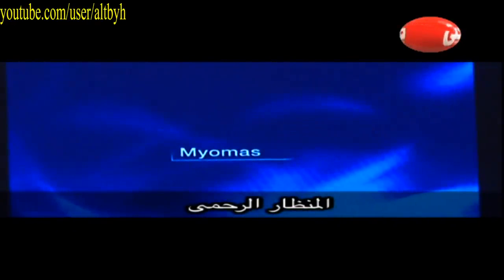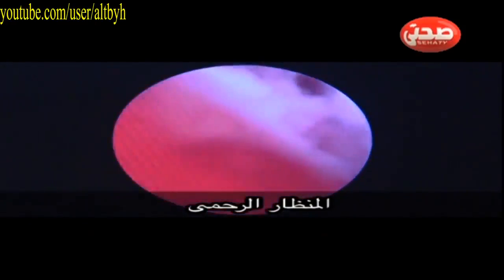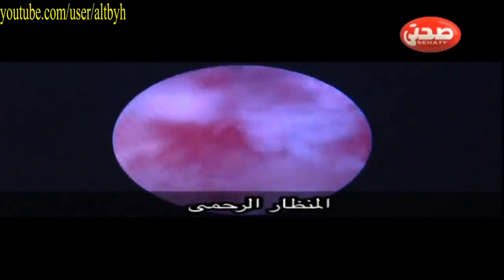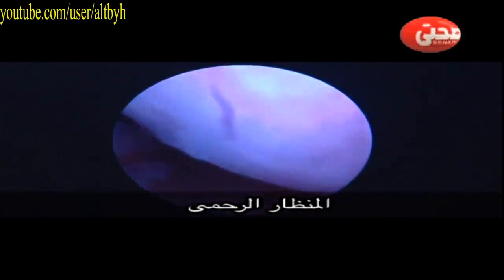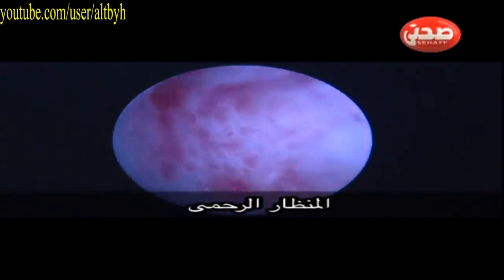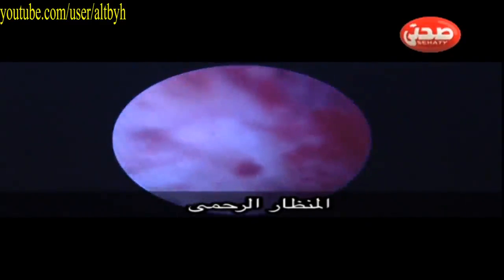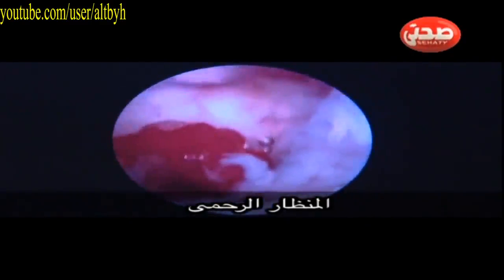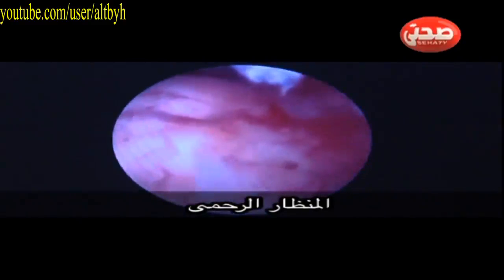Also, you can find myomas. Like in this case, once you are in the cavity, you can find a large submucous fibroid. You can see the peripheral vascularity, which is very characteristic of myomas. The important part of the hysteroscopy is that it can also allow therapeutic treatment, so you can add the resectoscope and remove the myoma.